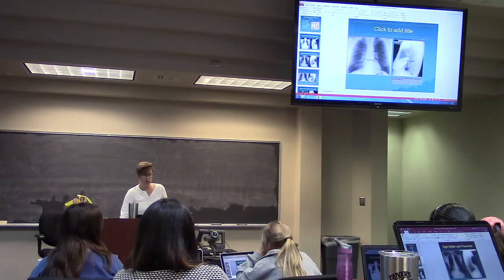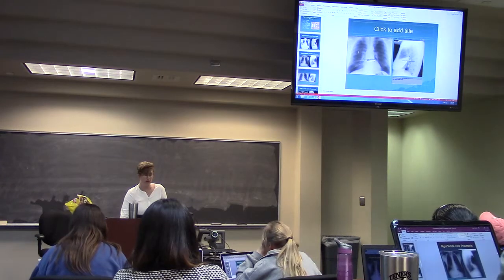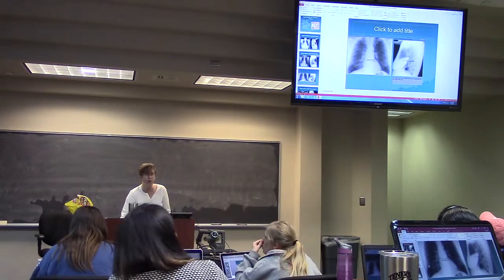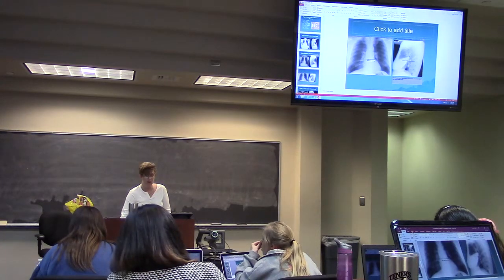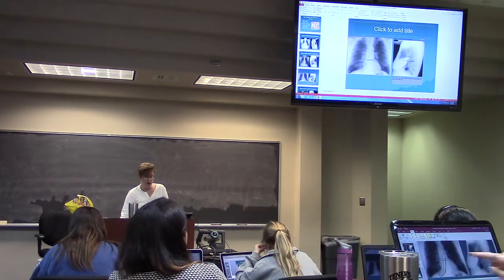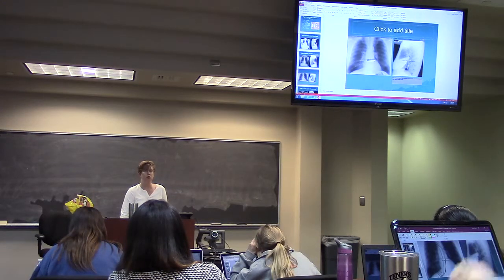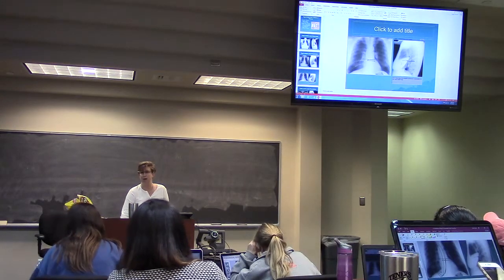If you look right and left, this side is darker and this side is lighter. And we get a little bit of blurring of this side. It's not as bad as the other one, but we know that this is whiter over here. This side looks black, this side looks whiter. And there's a little bit here of blurring. So when I look at my lateral, that's why they're so important to look at both, I can see that there is actually something going on in that middle lobe.